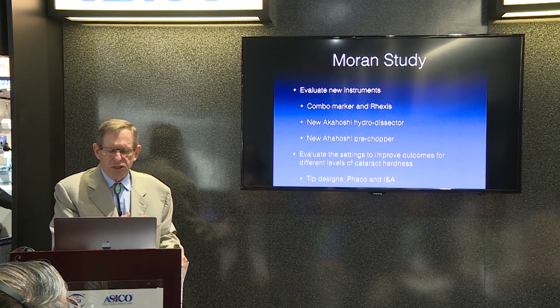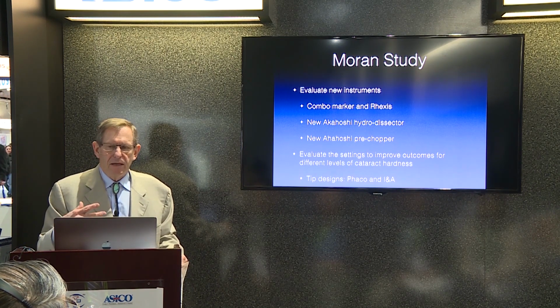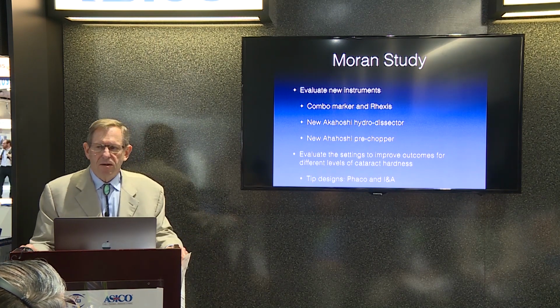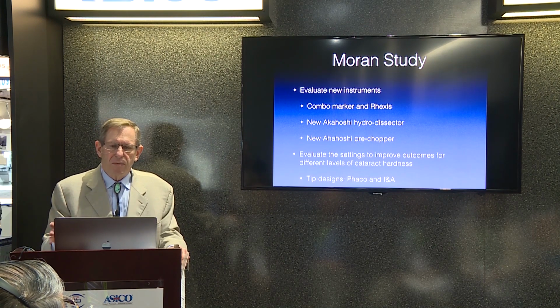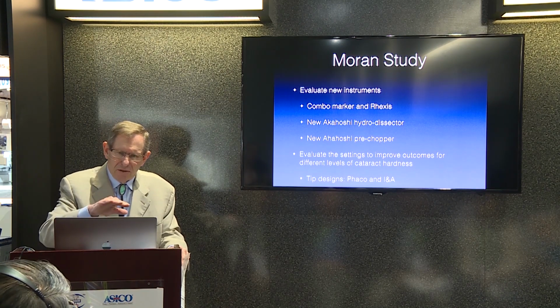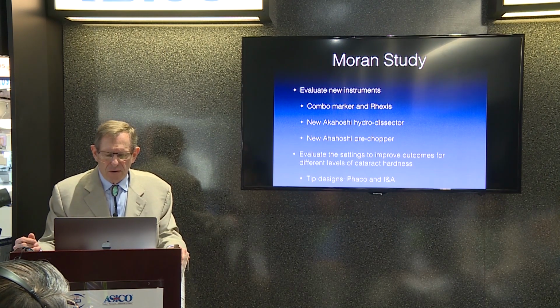I've been using the Chang cannula for 10 years or whatever. I've switched to the Akahoshi because I get better hydrodissection. It's easier. I have not had a failure with it. It's hard to say how many failures you have with a Chang. Not many, but this has made it significantly easier for me, particularly when I'm teaching residents, because they often don't understand tilts and things like that, and it's designed in such a way that it makes it easier, and I think you'll show examples of that much flow.